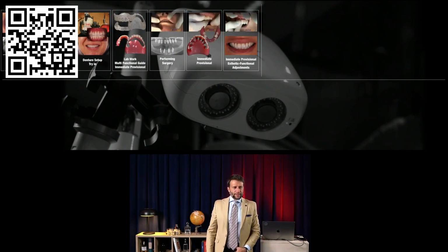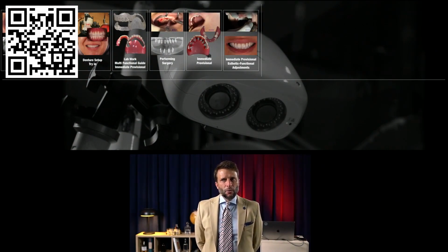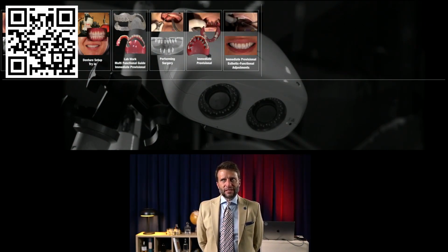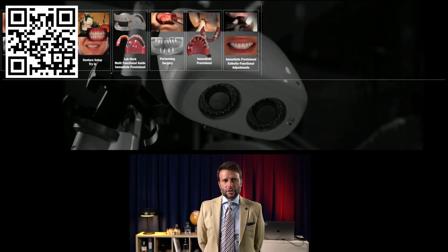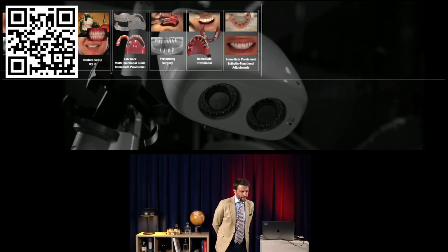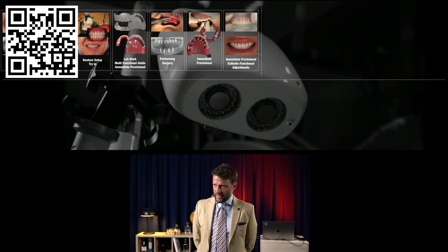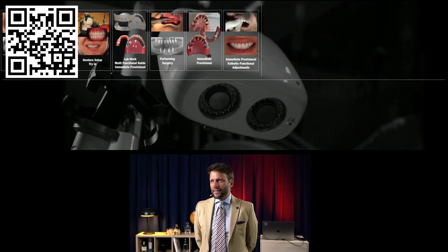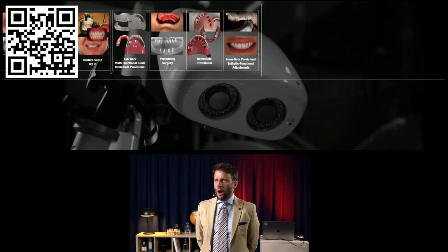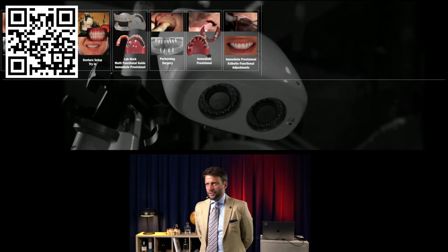So this is just a quick comparison. Look how we used to do these cases. I have to tell you, working with full implant arches without digital was challenging. And all the doctors that were doing a great job with full implant arches without technology, I have to give huge credits, because so many things could go wrong, and they usually did go wrong, and we had to redo and cut and splint and manufacture again.